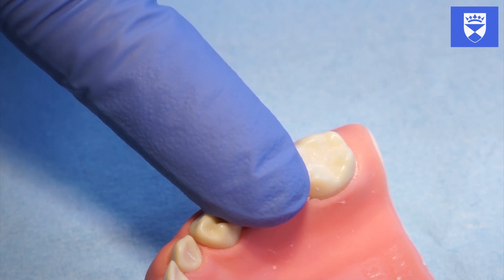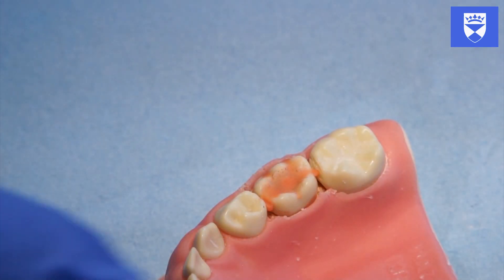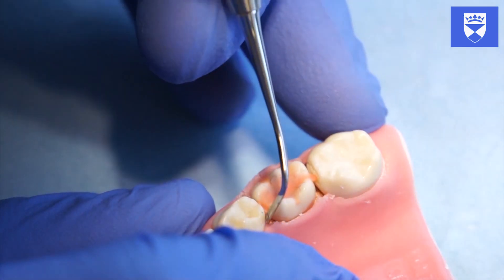Remove your finger and quickly examine the restoration while still maintaining moisture control. The glass ionomer should fill the fissure pattern and follow its shape without being too bulky. There should be no voids or defects.